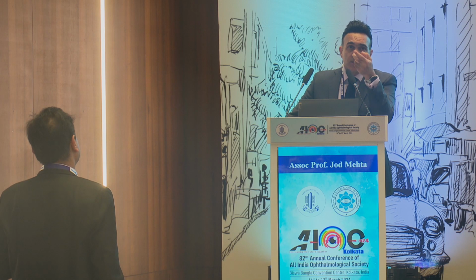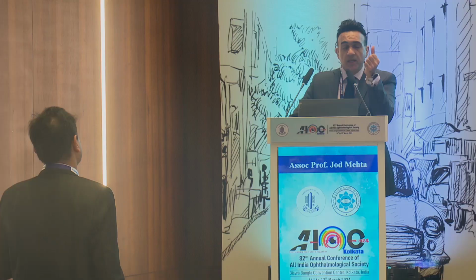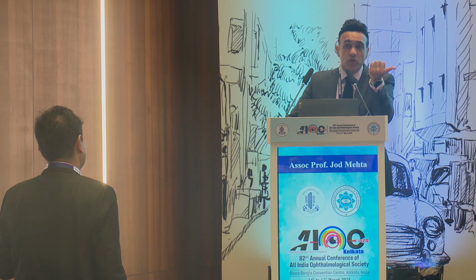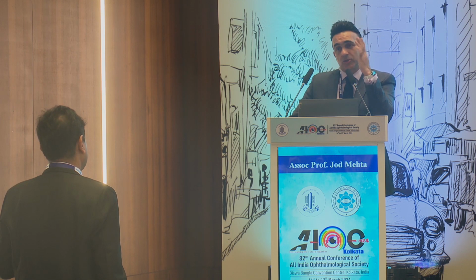So when I see the inlays in, if there's no hyperopic shift and they have a cataract, then I do the same. I do cataract surgery on them and I aim for a myopic outcome like 0.5, 0.75 so they can start to try to use the inlay. If the patients have a hyperopic shift pre-op, then I either pre-treat them with steroids or tell them to remove the inlay first, and then I tackle the problem by treating the haze, and then I do the cataract surgery after that.